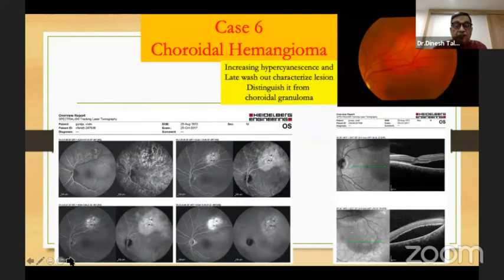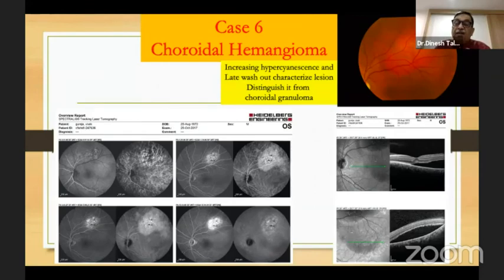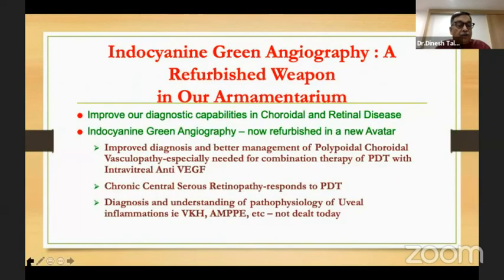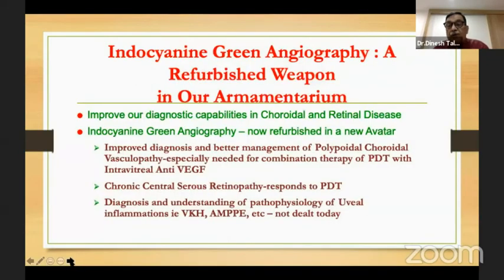The last important topic is choroidal hemangioma. This patient shows filling which increases in the early phase and then washes out — this is characteristic of a choroidal hemangioma as opposed to a granuloma. Here is another patient that looked like a large granuloma, but the ICG shows early filling that becomes intense and then washes out, whereas on fluorescein angiography it just becomes more and more intense. So you can differentiate a choroidal hemangioma from a granuloma.